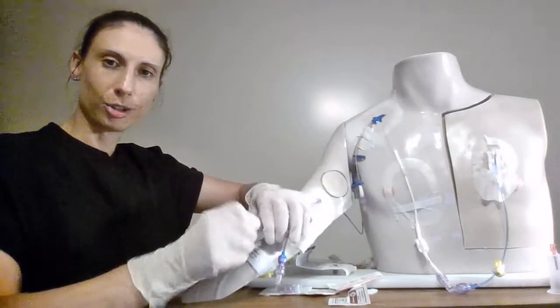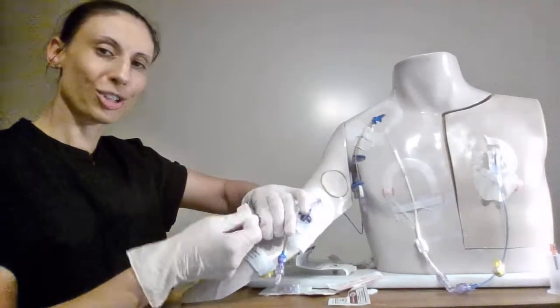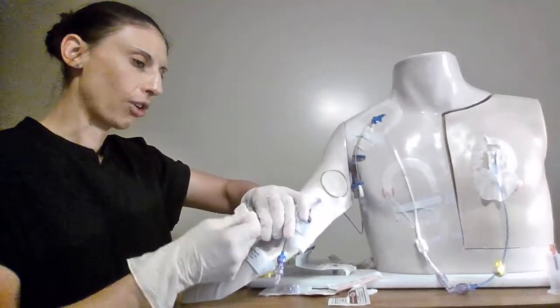I'm going to pick the red lumen so I'm going to come to this port and I'm going to clean it 30 seconds and I'm going to let it dry for 15.